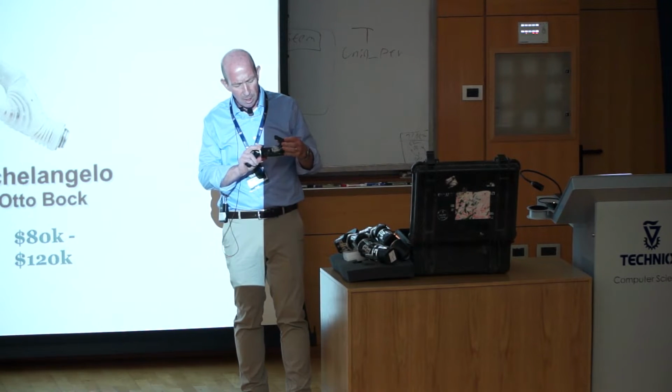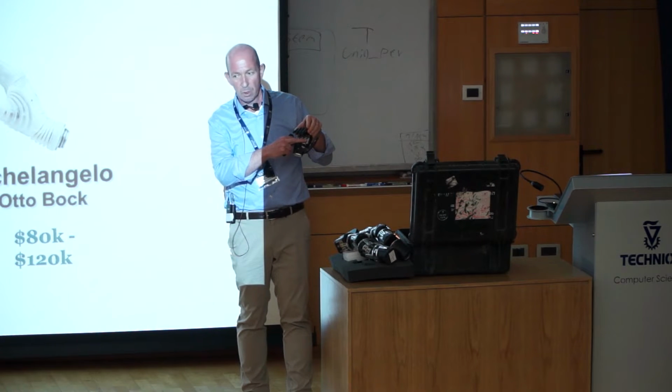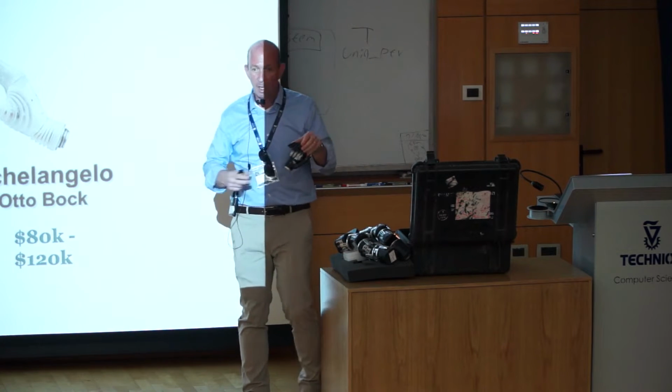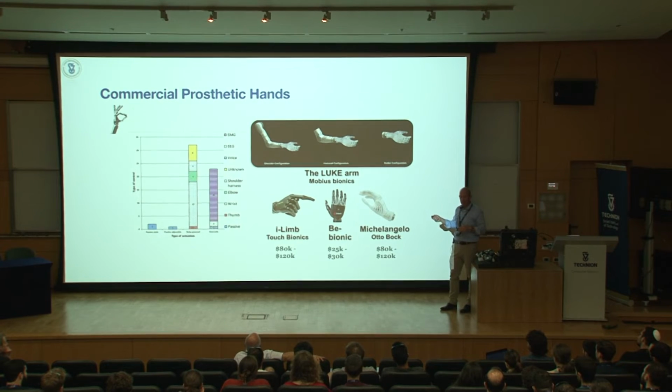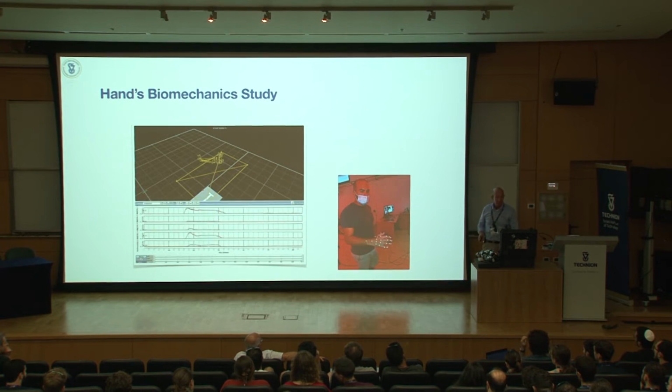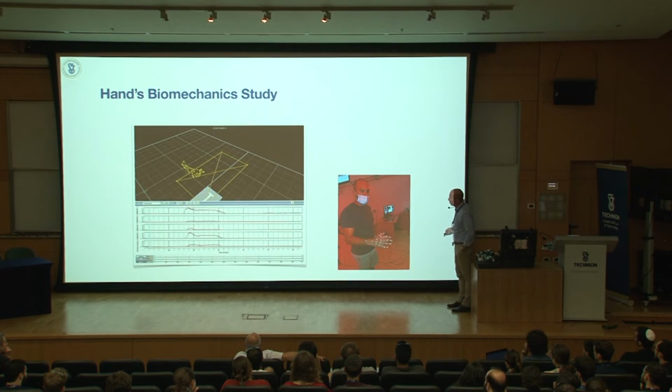And just to give you an idea, each motor here, which are from Pittman, is about $700. Now, the hands that we are designing are limited to a maximum of $100 per hand. So you can print it and do it everywhere in the world. It's all freely available. So this is Dean. Dean is doing his master's and now PhD with me and Alex Bronstein. Poor guy has to satisfy three professors.